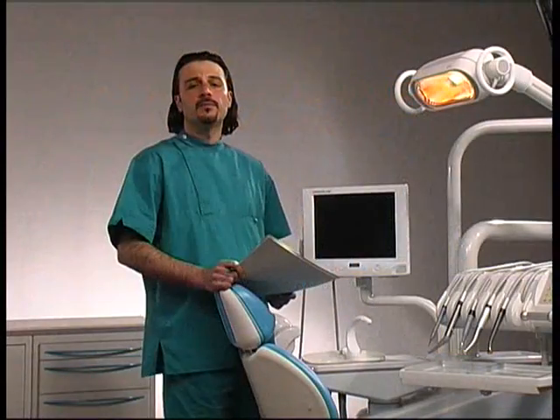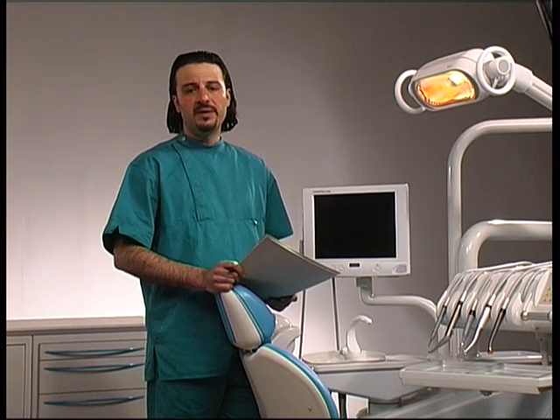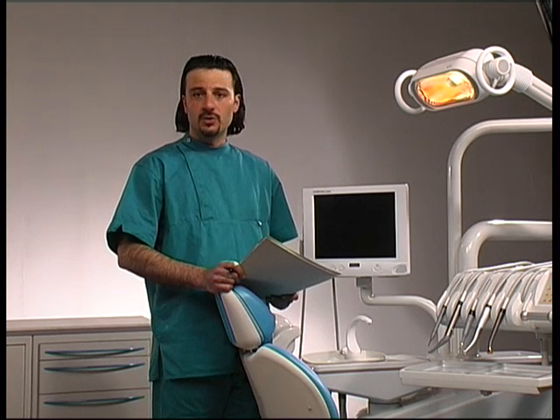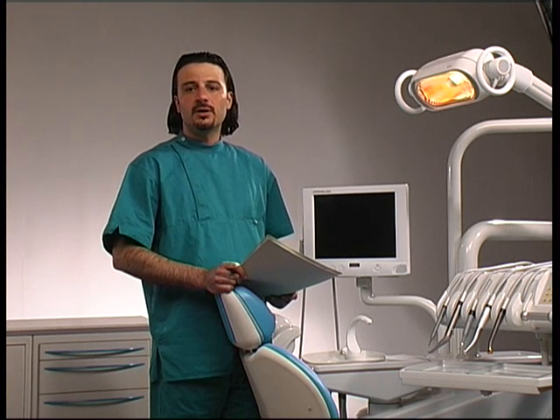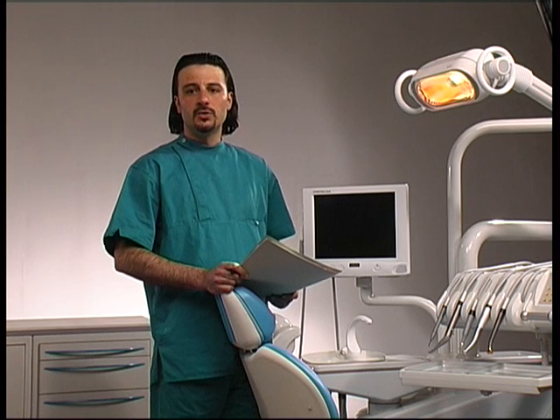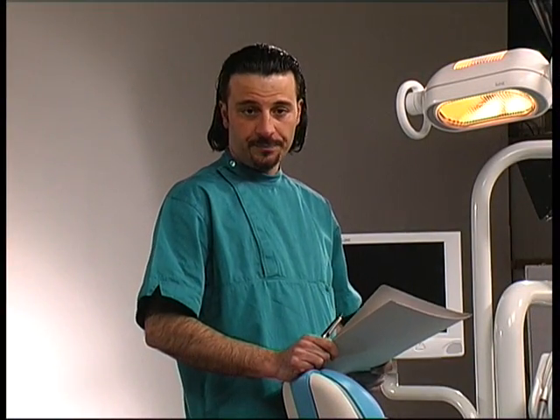The purpose of this video is to provide information on the surgical protocols normally adopted in operating theatres, adapted to the problems of ambulatory surgery. The particularly high risk of contamination during surgical operations has been demonstrated in numerous studies. To reduce these risks, we need to create protocols that define suitable operational procedures. The aseptic technique is a valid tool that can be used in the design of these protocols.